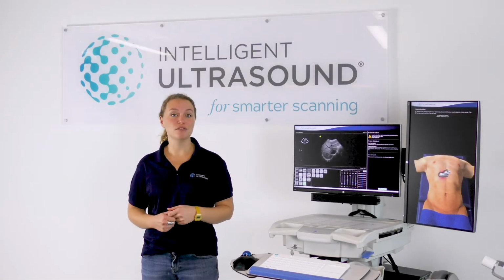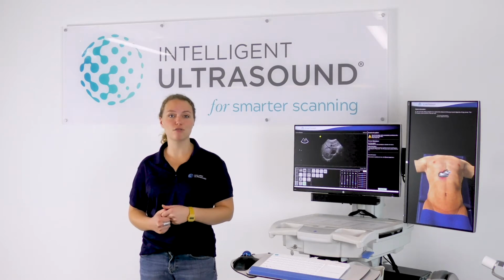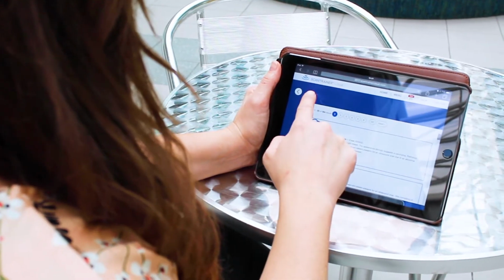ScanTrainer Cloud includes a range of features which extends the teaching scope and learning potential for both tutors and trainees, giving tutors flexibility to manage their programs from the comfort of their own home or office, and learners can complete the pre-scanning learning resources from home too.